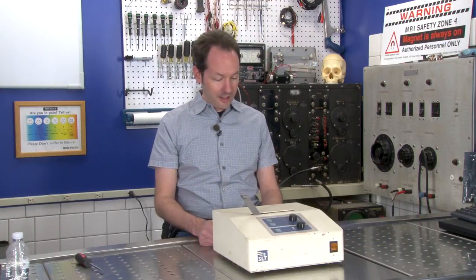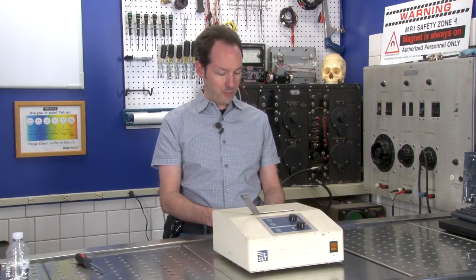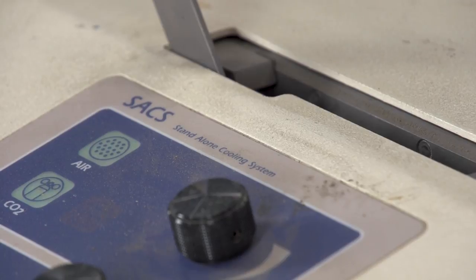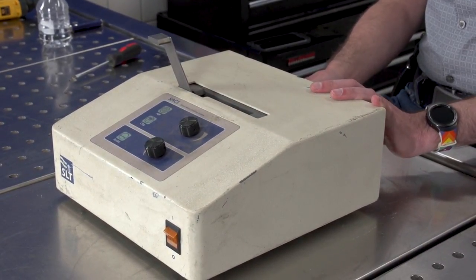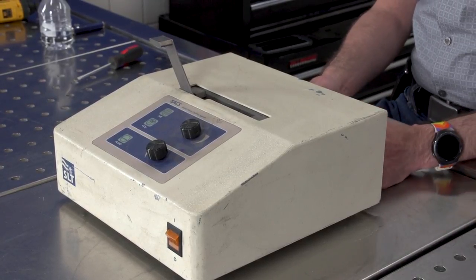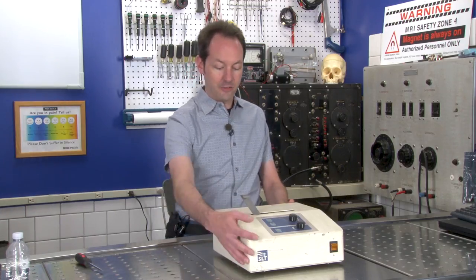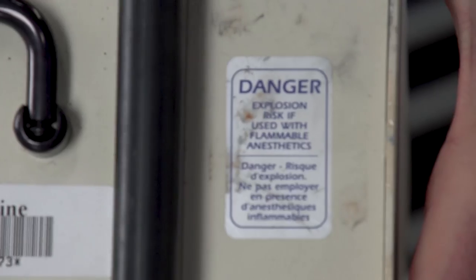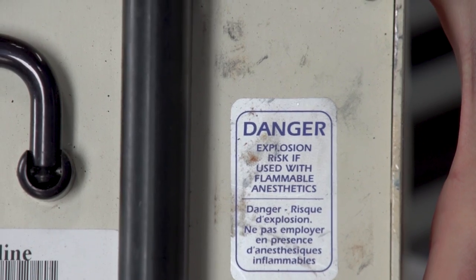Hi there guys, I'm Chris Bowden and welcome to the Geek Group. In today's equipment autopsy we have a stand-alone cooling system from Surgical Laser Technologies. It's part number 0101-6090 Revision 3, serial number 75 — they sold a lot of these. This is from June of 96. And anytime I get to play with something that has a sticker that says 'Explosion Risk if Used with Flammable Anesthetics,' you know it's a good day.